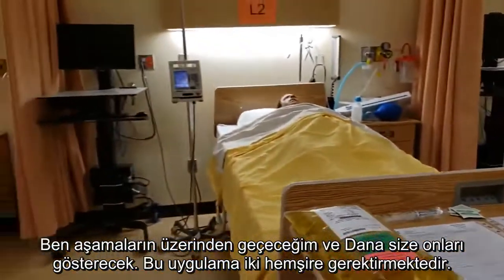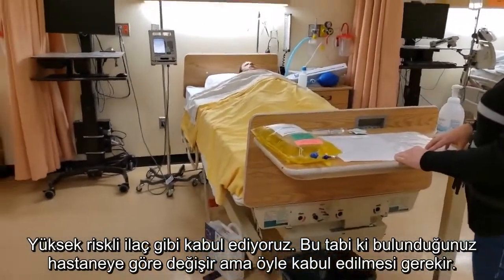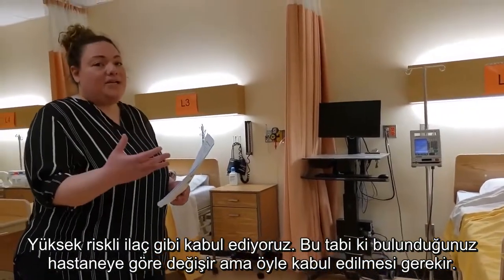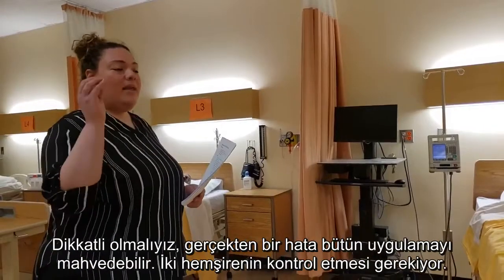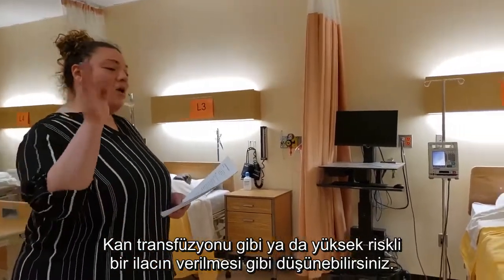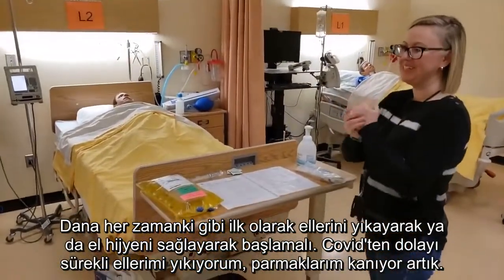I'm going to be walking through the steps and Dana is going to be showing them. This also requires a second nurse — we consider this like a high alert medication. It depends on the hospital you're in, but it should be considered like a medication. We have to be careful. We can really mess things up if we give it without having a two-nurse check, kind of like blood. Think of it as a high alert. So Dana is going to start by washing her hands or doing hand hygiene — that's the first step.